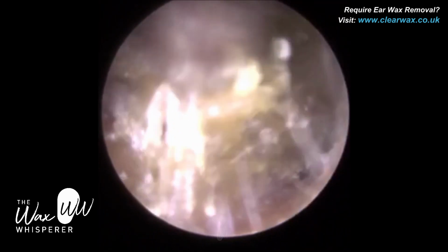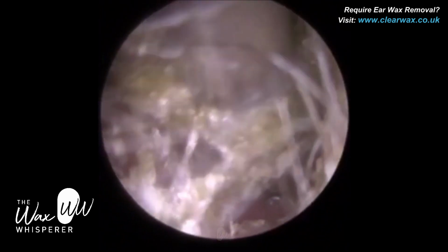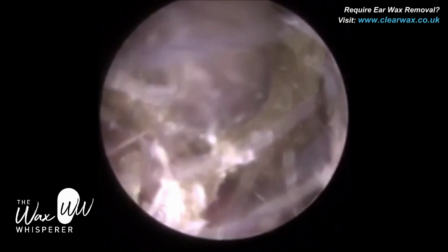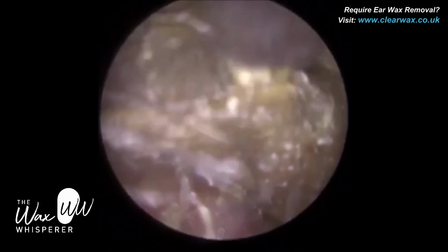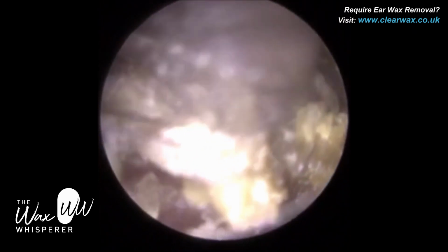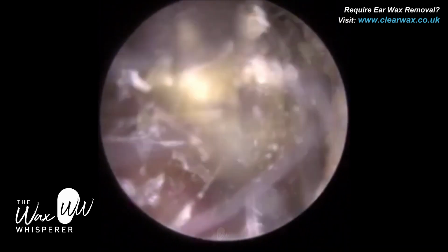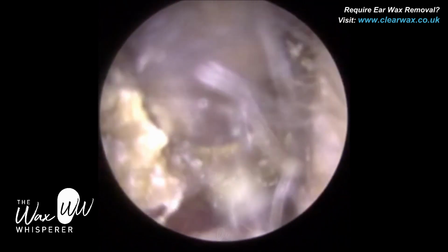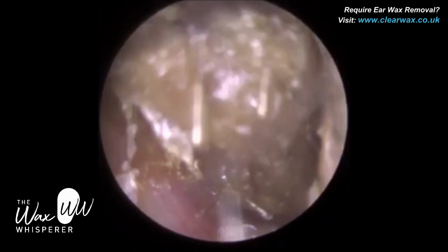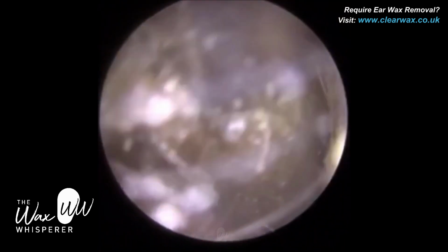So we're just on the right side, and again, we're quite lateral here. Whenever you see hairs like this, you know we're near the entrance, so that's a good indicator. Plug of wax is a bit more stubborn on this side. It's a bit sticky, gooey, just like the other side, and I'm just trying to elevate the outer rim of the plug of wax, where there's skin, off the canal wall. I'm trying to detach it. So this plug of wax is encompassed with a layer of keratin, dead skin.